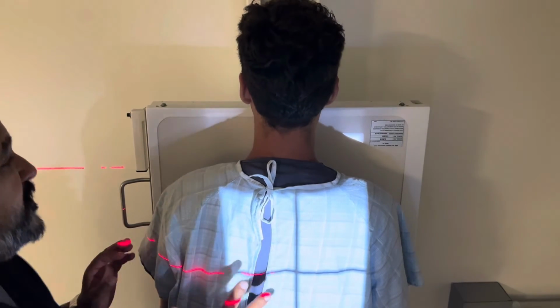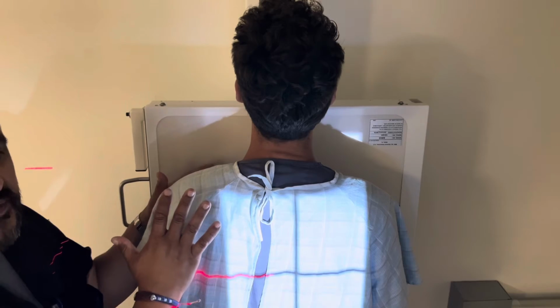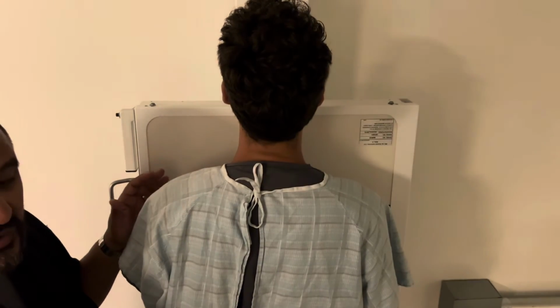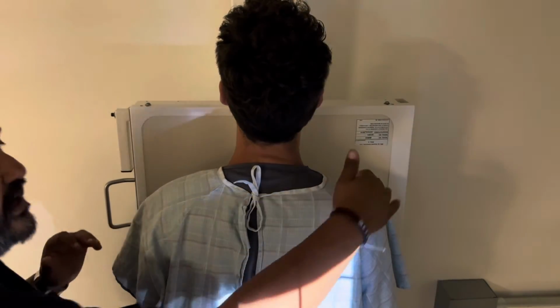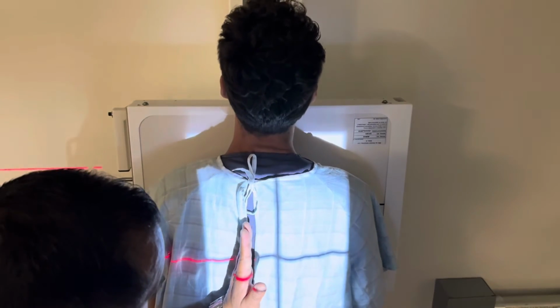So now, here's where it gets a little funky, okay? You still want to try to keep the part closest to the IR. But when it comes to the obliques, we're going to have to turn them to where the spine's not going to be in the way. So this is where people get a little confused, but I'm going to try to keep it as simple as I can. So let's see, he has a right anterior rib injury. All right, so again, I want to try to get his spine here.